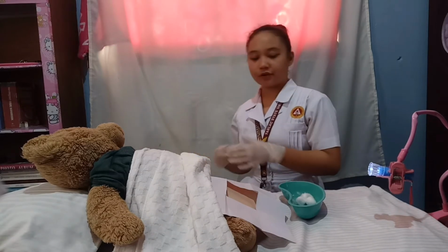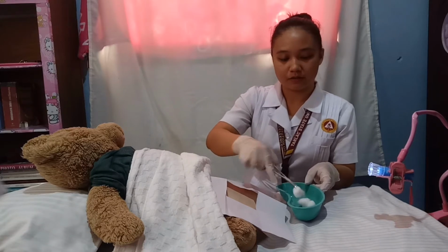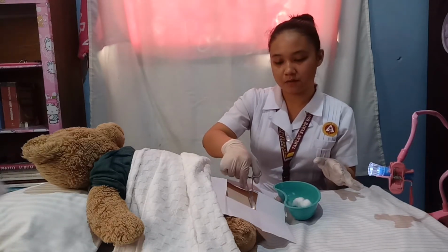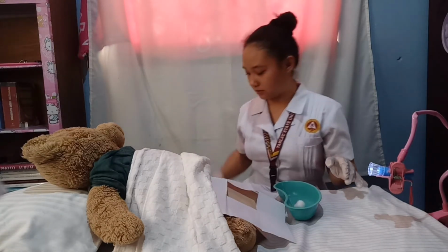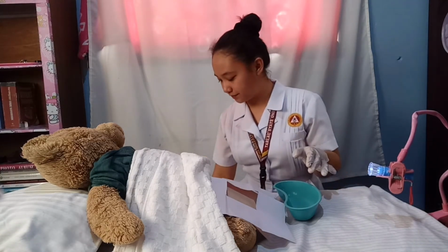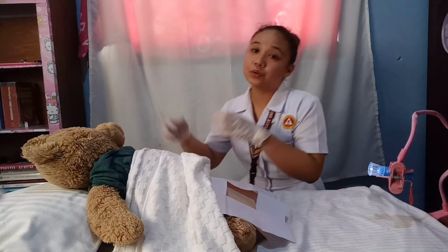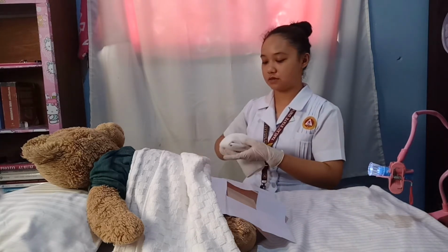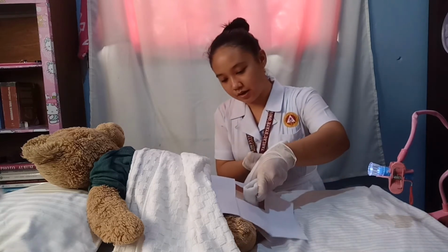Get the Kelly's or forceps, and then, from front to back, one swipe and then discard. One swipe, then another, and then discard. Then put this way, and then you need to rinse it and dry. So here, this one, and then dry.